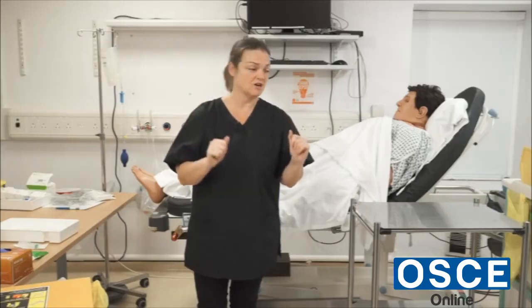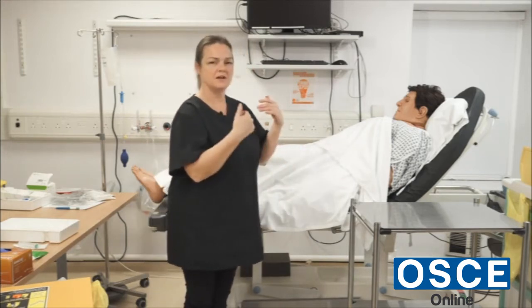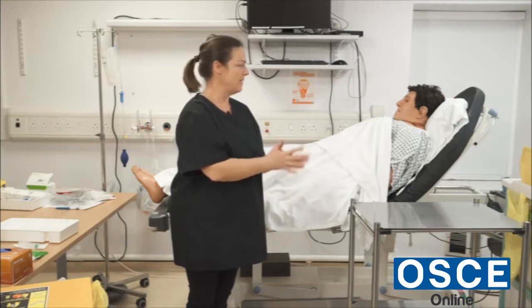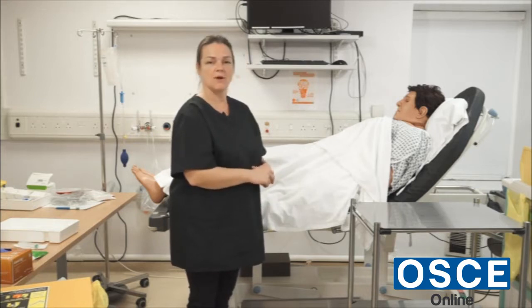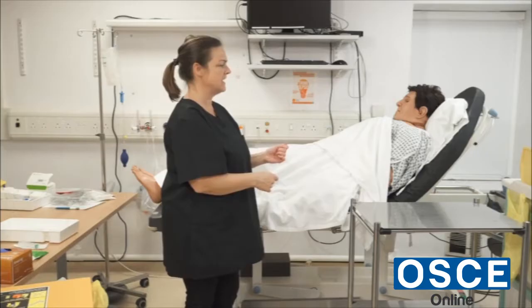I'll assume that I've introduced myself, that I've got the patient's name, the identity check has been correct, the allergy check and the comfort checks have all been done, and the patient is quite happy for the catheter to be removed. I would screen the area for privacy and dignity.